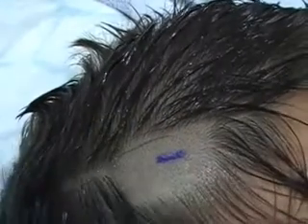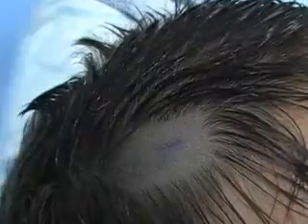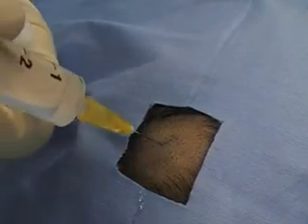Wipe the frontal area 3 times from the center to the periphery with an antiseptic solution. Then place a sterile fenestrated drape over the head. Larger sterile drapes may also be used, but follow local guidelines. Raise a bleb with local anesthetic.